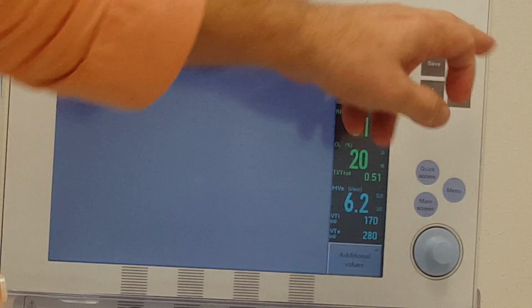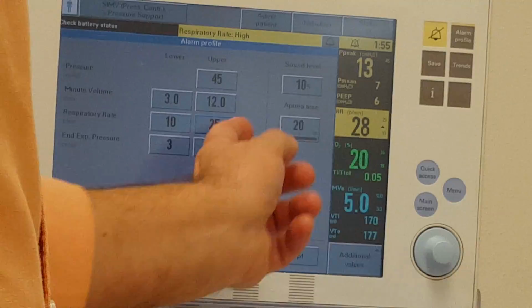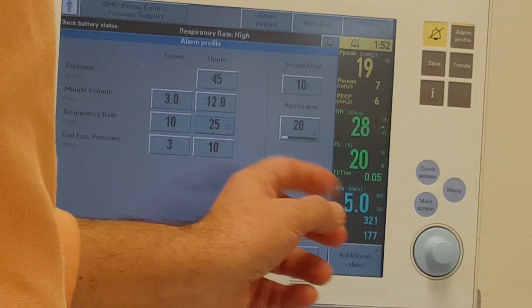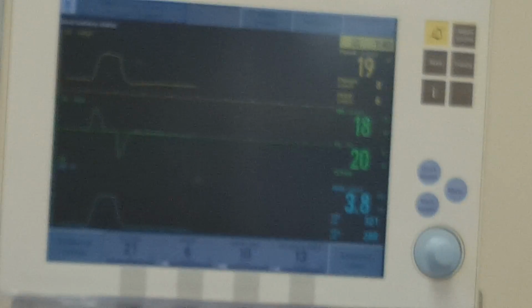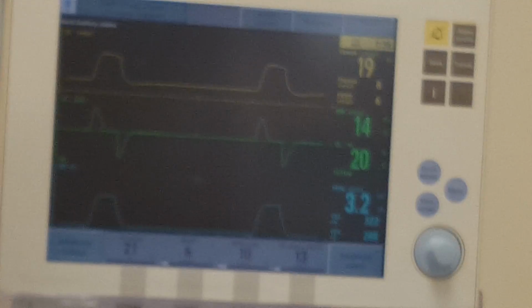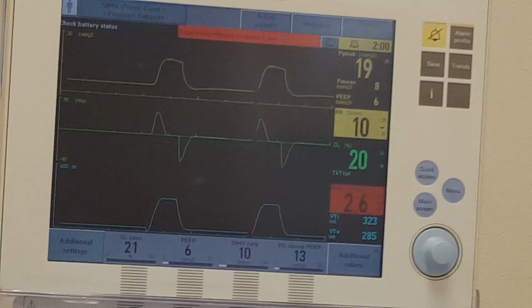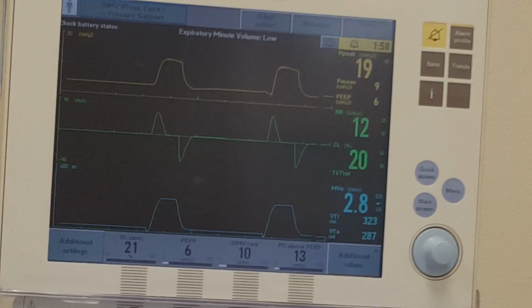Well, before we do that, let's turn our high respiratory rate up, because I actually want to show you some, I'm having trouble doing that. In order to keep the glare off the ventilator face, I put it very square to you, but that means when I'm angling to make the changes, I'm shooting too high. So it's hard to get it that low. Okay.